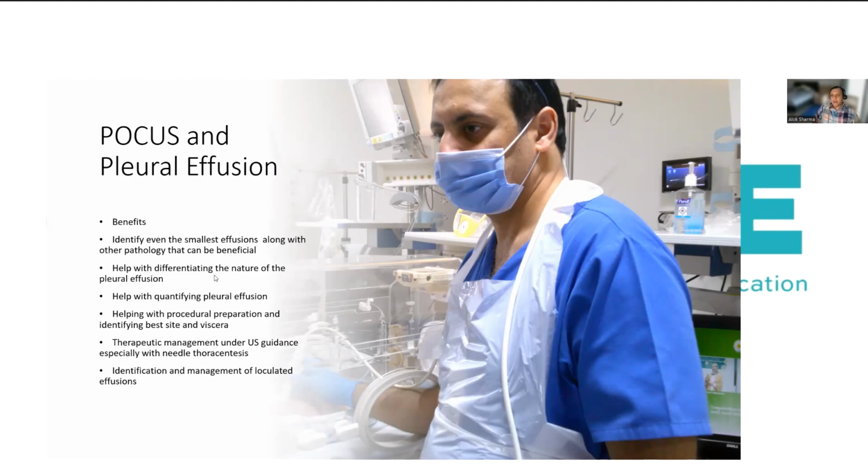We now have good evidence from work that's been done in children and adults that you can actually quantify and measure pleural effusions. There is a very good piece of work which has been done by Balik and his colleagues, and I will actually talk about how you can use that in neonatal practice today to try and quantify how large a pleural effusion would be.